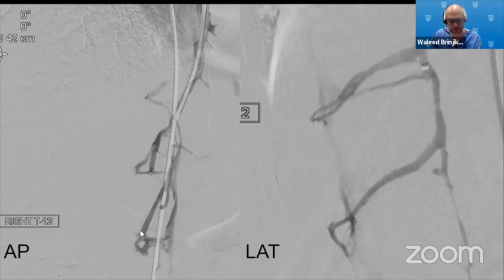And this is why the surgeon, when they treat it, obliterates all the veins in the foramen and lateral epidural plexus. So when I do the embolization, I like to see the Onyx here in the lateral epidural space, underneath the pedicle and the neural foramen. I like to have this whole ring filled with Onyx. And these little things here are little branches that are going into this ring.